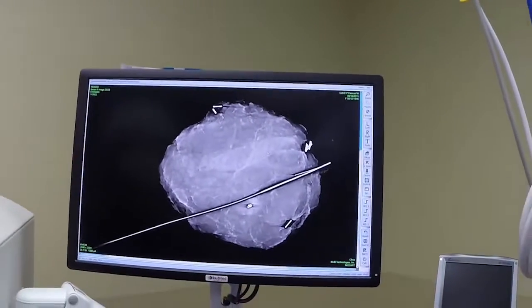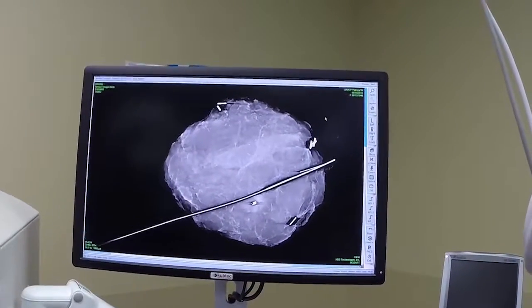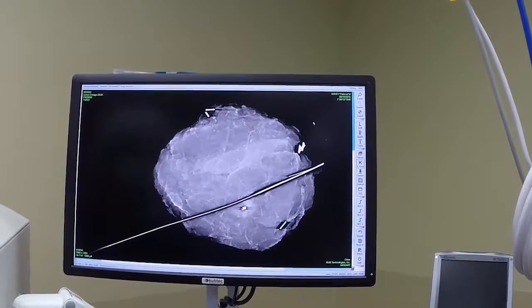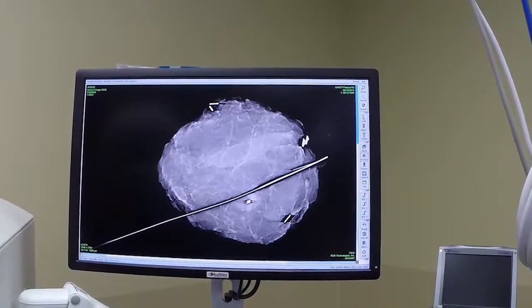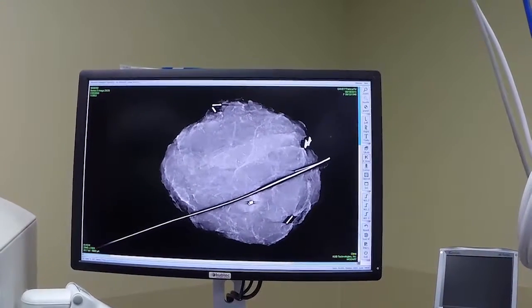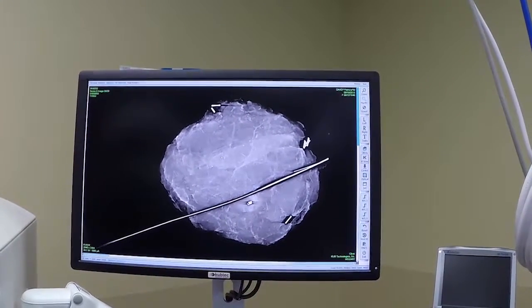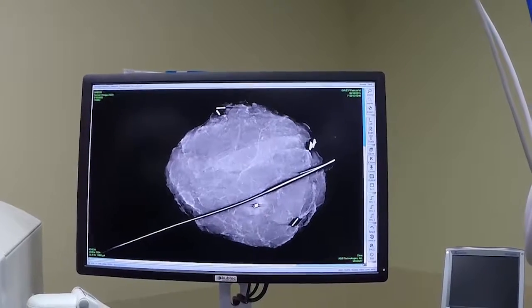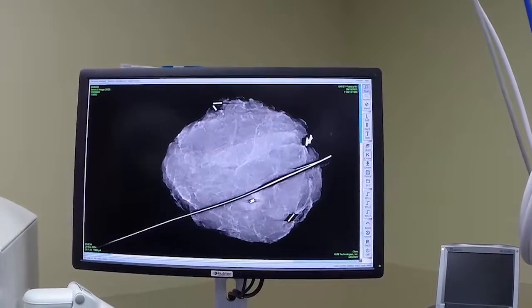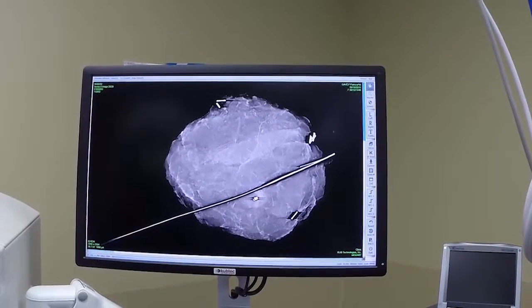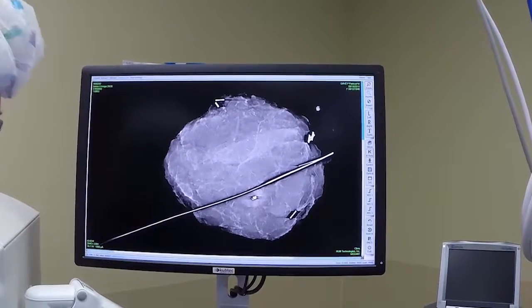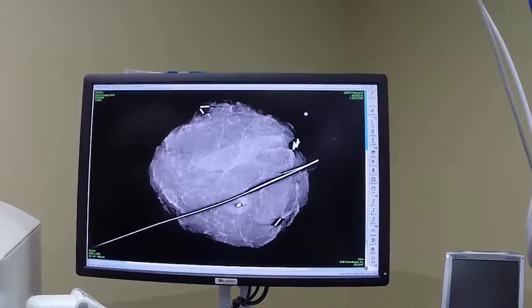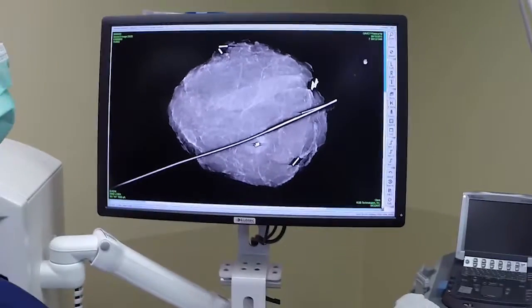Do you want it to zoom in a little bit more? Yeah, you can center it. If you hit the zoom, then you can just center it a little bit more. Okay, that's fine.